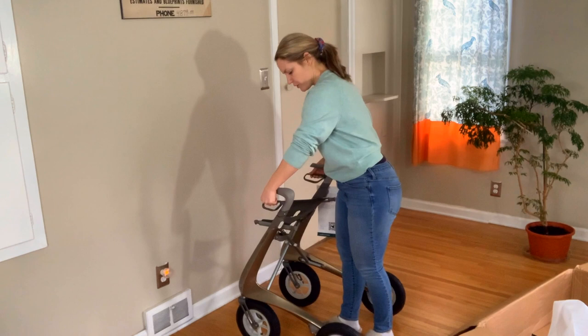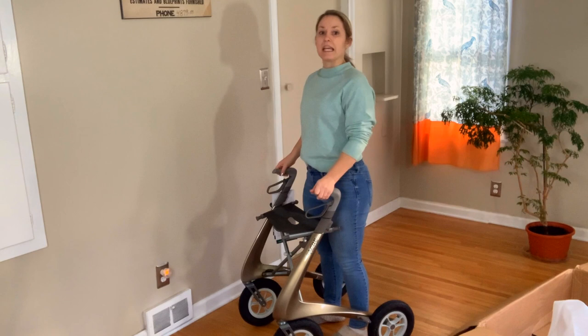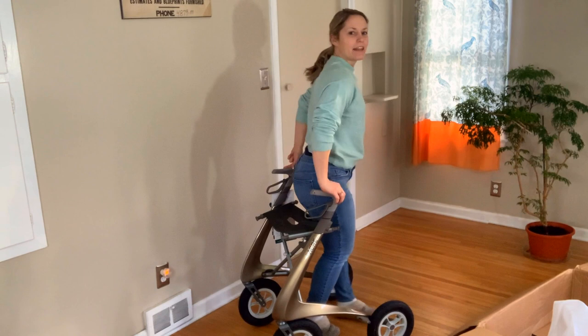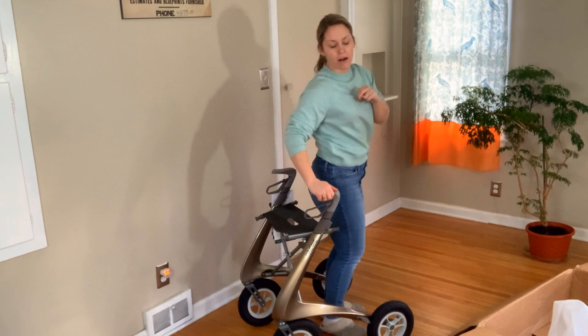I'm gonna sit in it just to show you. Put the brakes on, you can sit down. One thing that I love about the Biaker is the forward-facing handles. This allows you to be nice and close, centered in the rollator, which allows your core to feel more supported and allows you to have better posture. I love the forward-facing handles. I love how high the seat is. I love anything that allows you to navigate the world at almost your regular height, because that's something that allows you to communicate with others without sitting all the way down in a wheelchair.